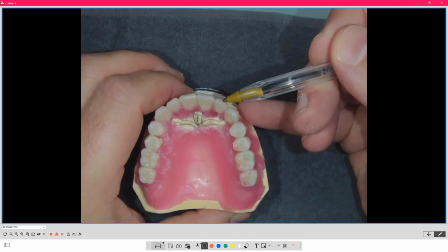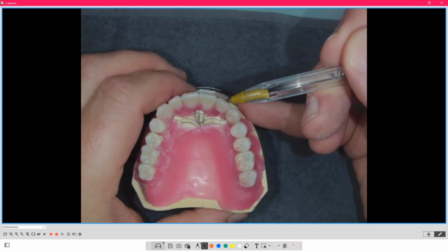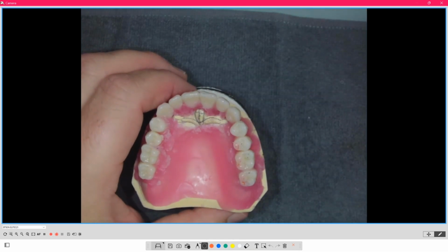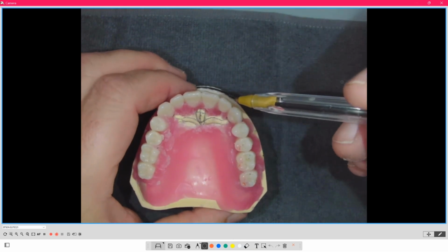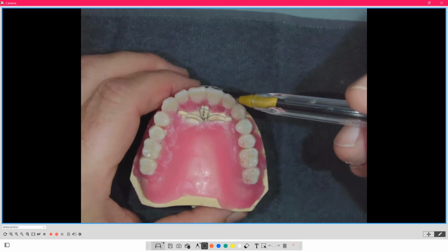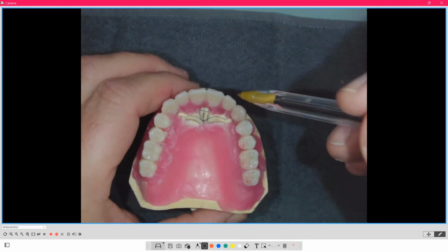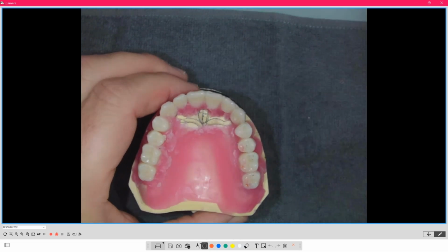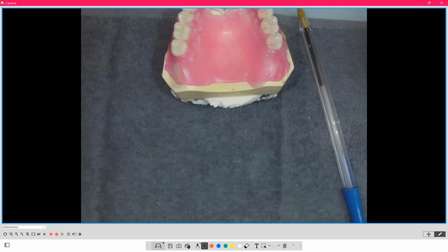So my comment to them was, this tooth is telling you it's in the wrong position. If it breaks once, I could say, it was a one shot. It happens, things break. But when it breaks repeatedly and you're on your 3rd or 4th tooth now, and the patient's frustrated and you're frustrated because you're fixing all this for free, it's telling you it's in the wrong spot. Now you need to decipher and determine, what does that mean?